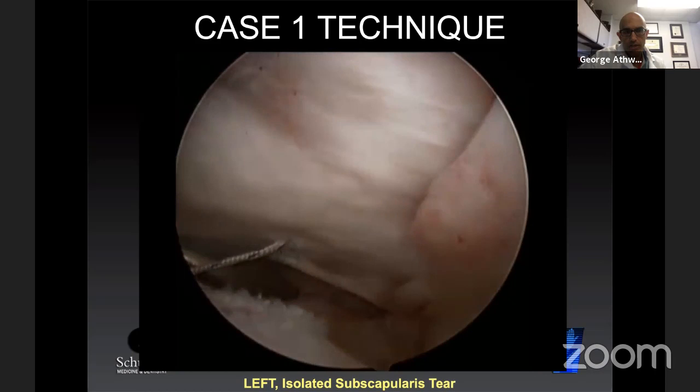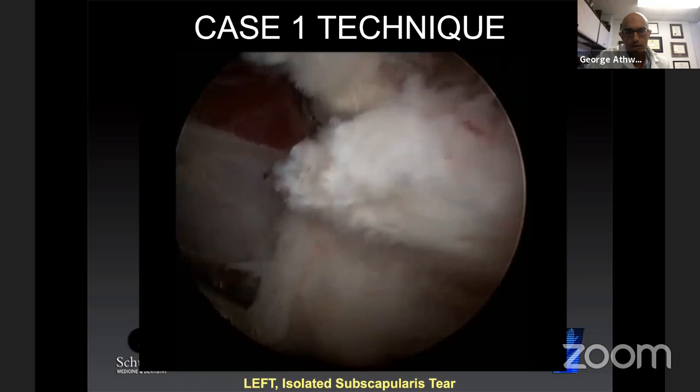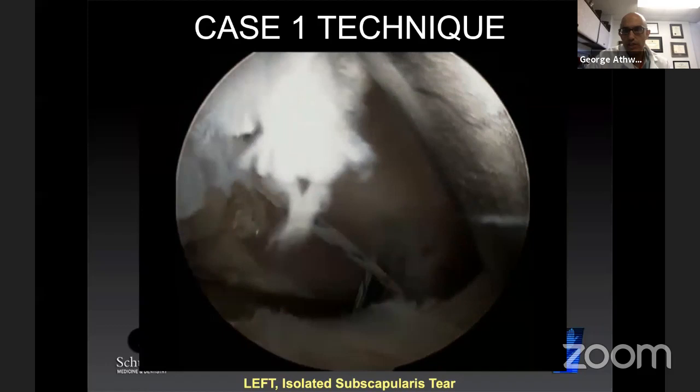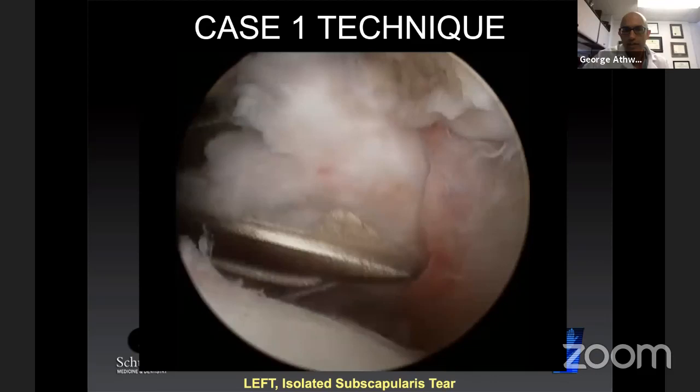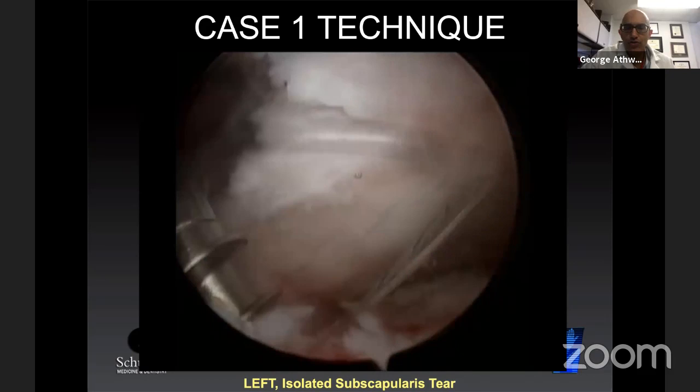We're coming in with the antegrade suture passer from that anterolateral portal. My fellow is holding on to the tendon, functioning as a traction suture. By grabbing the tendon, he has a dynamic traction instrument that he can move the tendon around to make it easy for me to pass the sutures. All of these sutures are going to be passed in a mattress type technique. There they're all passed.